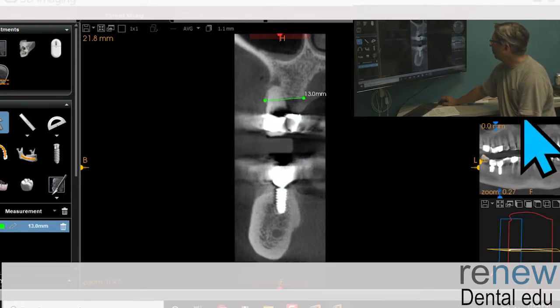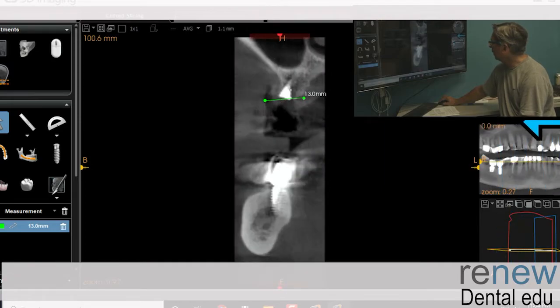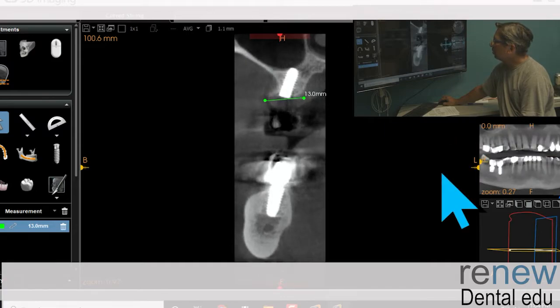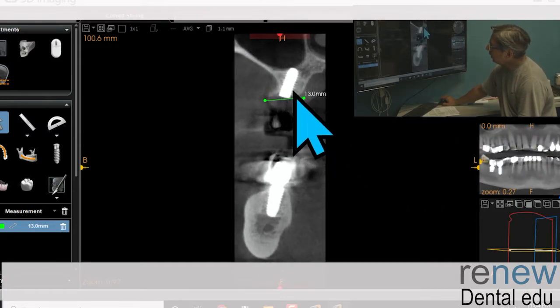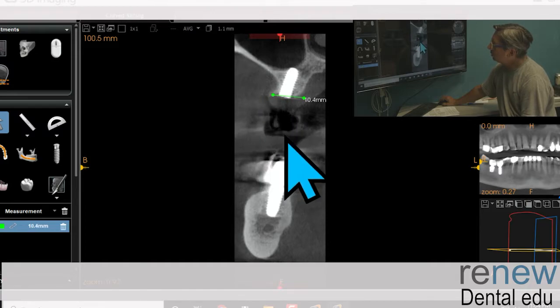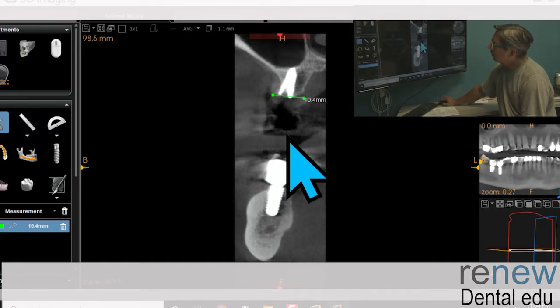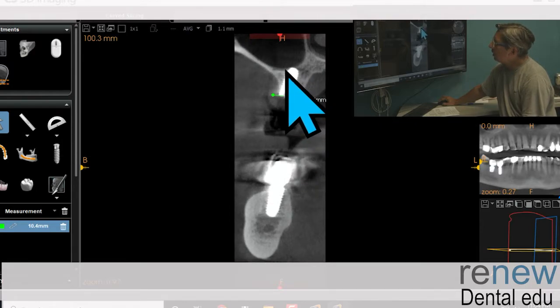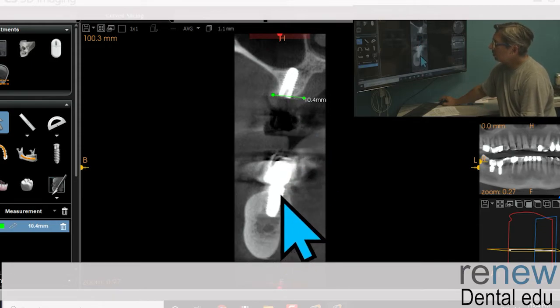And on number 14, we actually see that he's maintained the bone height pretty well as well. It looks like it's a little more narrow, and this implant's a little bit angled, but that seems to be okay. See, the width is a lot shorter, but he's got a tricky scenario. But what I like about this is that it is hugging right into the base of the sinus. This implant is strong. Both of these implants are very strong. Look at that bone. This is very well healed.